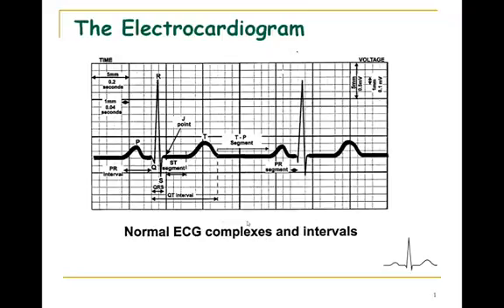This webinar corresponds to part of the lecture on the rhythmical excitation of the heart in the normal ECG. This part will only cover the ECG, how waveforms look the way they do, the normal durations and voltages of various waveforms or segments, and a little bit of discussion on refractory periods in cardiac muscle.